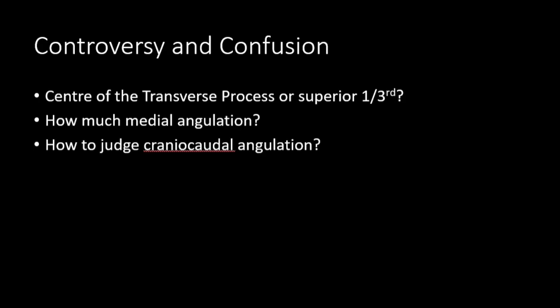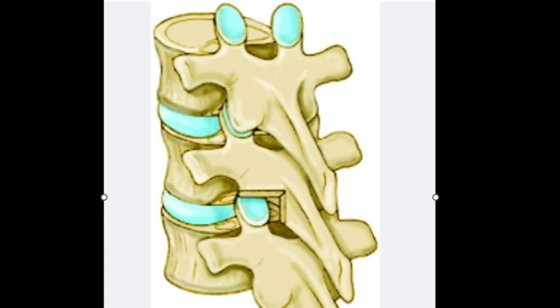We are going to study 3 or 4 papers, and we are going to discuss some methods, and then we are going to finally have our own method of putting in pedicle screws. To start with, we are going to look at some of the anatomical aspects of thoracic pedicle screws.